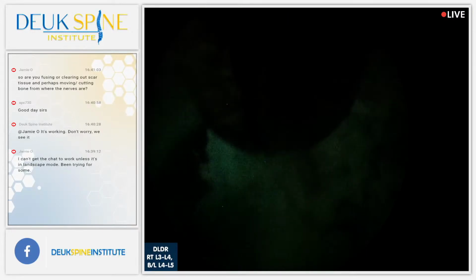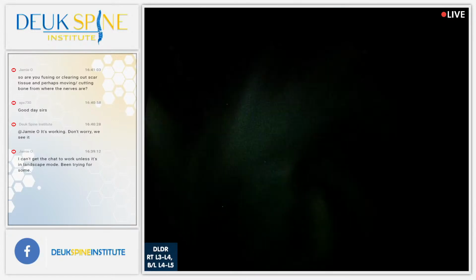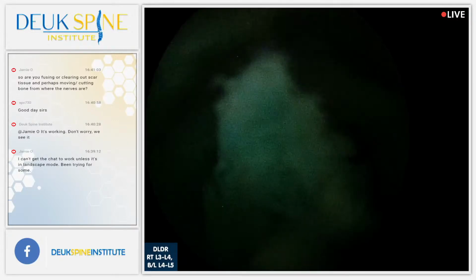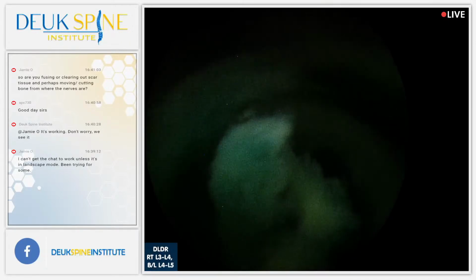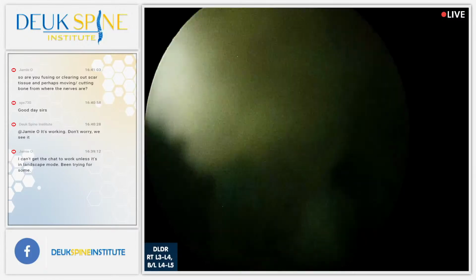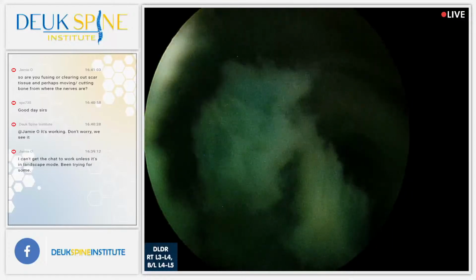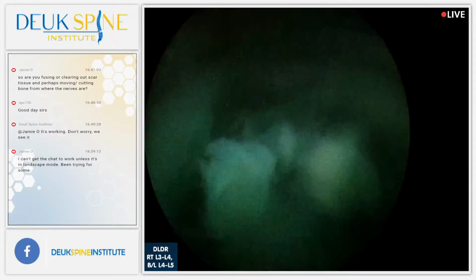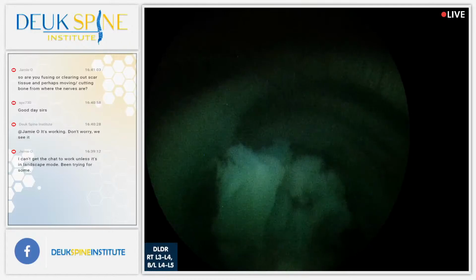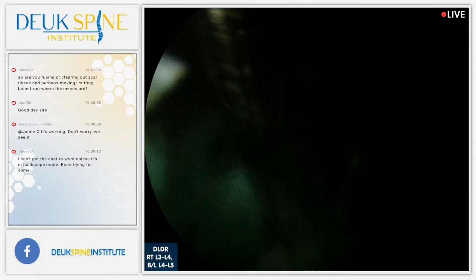All right, it's kind of dark. I don't know, I think the light's okay, or what we should do? It's still a bit dark. Right here, wipe that. Not sure, you check this connection here? Looks like that may be a little loose. All right, that's better. Those are all pieces of herniated disc. And they're floating out through the tube, which is good.